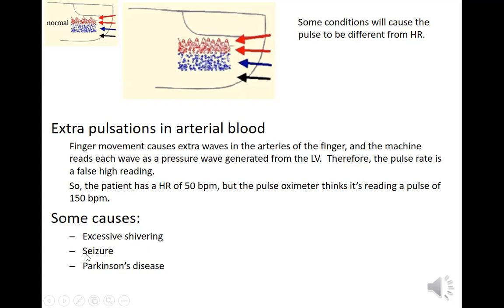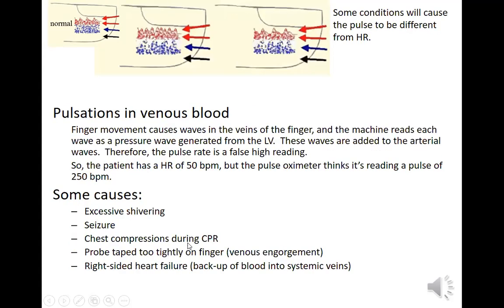And then, if you're monitoring and somebody has a seizure during this time, whether it's a short clonic seizure or an ongoing myoclonic seizure that goes for a longer period of time, you can see a change because of the contractions. Same thing with a Parkinsonian tremor, which can cause what really looks like an artifact. So the pulsations are really important, and the tops of these waves are your systole. And remember this, I know I said this a lot before, but what the pulse oximeter is testing, what the arterial blood gas is testing, like it says, is arterial blood. It's never dealing with venous blood.